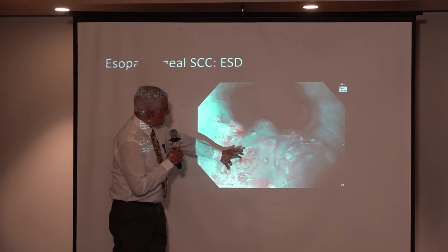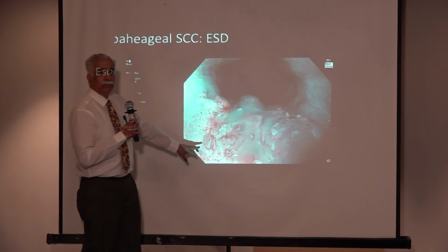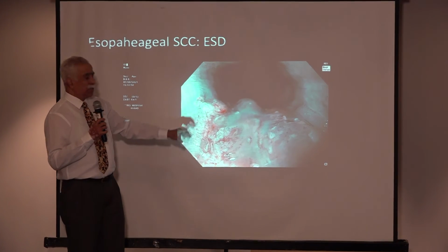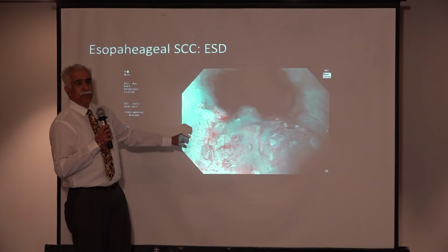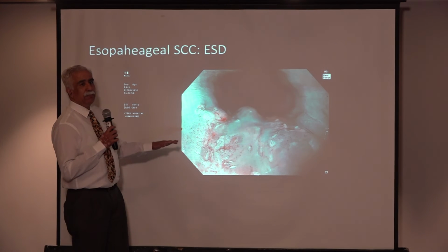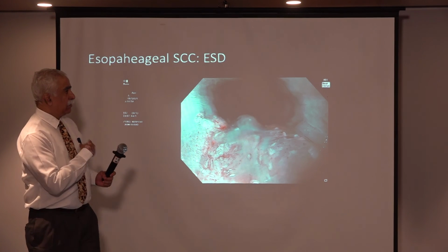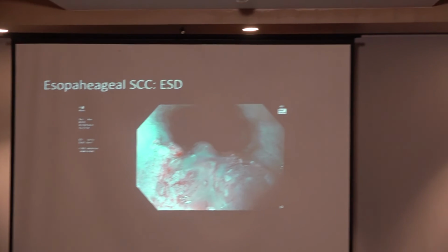But if you concentrate, look here, you are not able to see too many. Here in this area, you are seeing what is definitely B2. But if you come here, you're almost finding avascular areas. You're not seeing anything at all. And to me, this is worrisome and telling me that perhaps we're dealing with something a little more aggressive, and there may be submucosal extension. This is what I can see. Maybe if you have some more images.